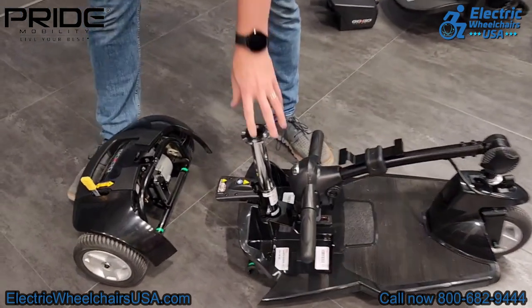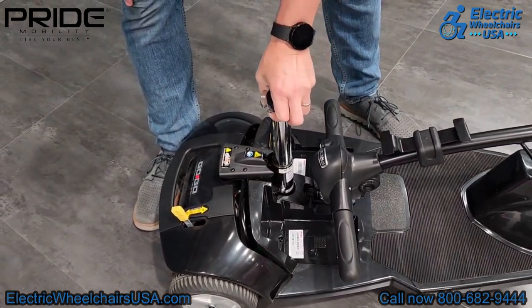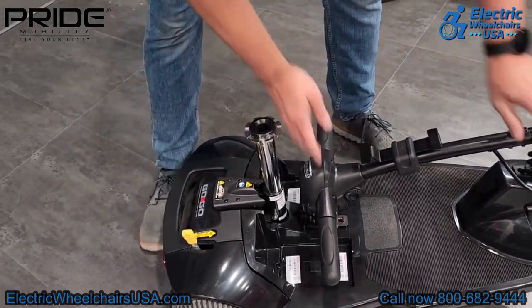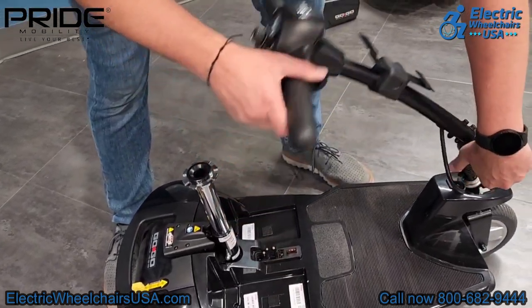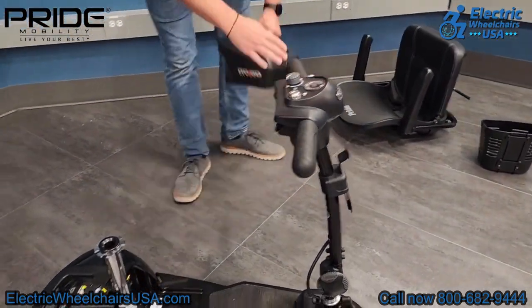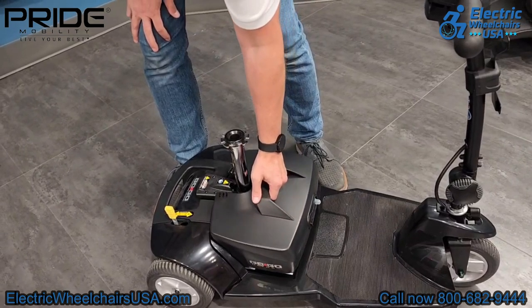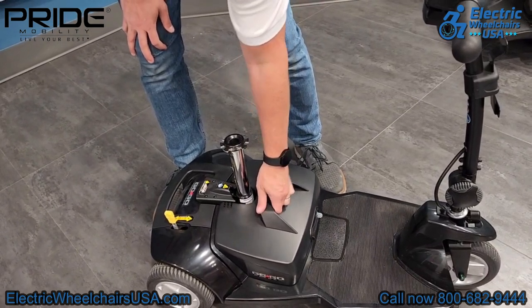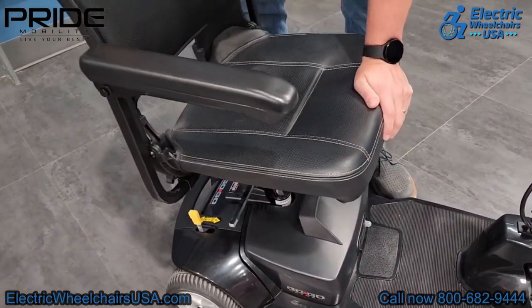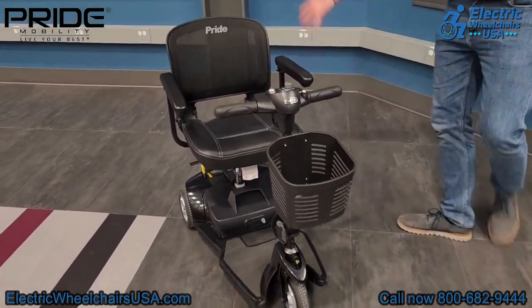Reassembly is simple as well. Take the front half of the scooter — there are two little hooks — line them up on the rear axle bar and let go; it will snap into place. Next, adjust the tiller up and lock it into place, making sure to unlock the locking mechanism on the front tiller so you can steer. Put the battery pack back onto the floorboard; metal connectors secure it in place. Then seat the peg on the seat post and drop the seat into place. Finally, slide the front basket back onto the tiller and the scooter is reassembled in less than 60 seconds.